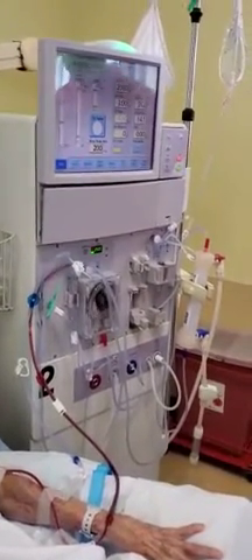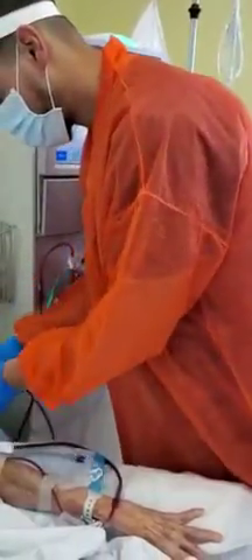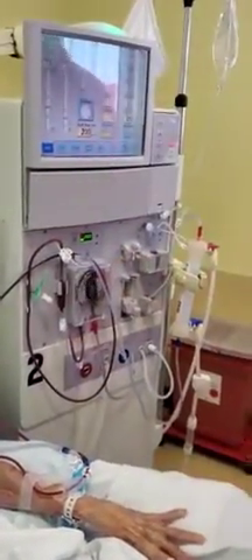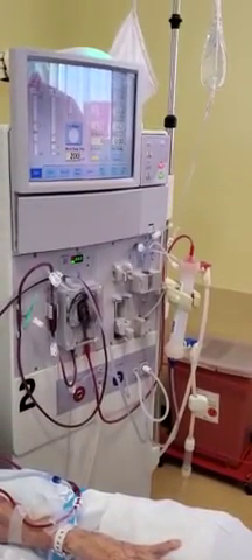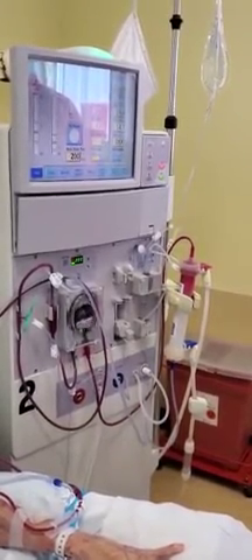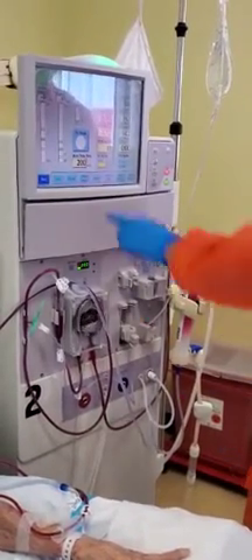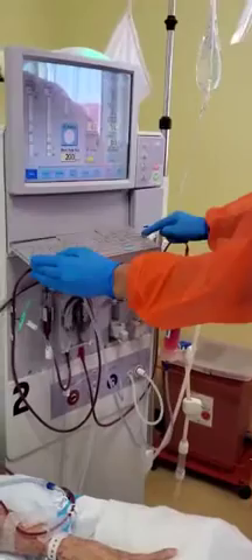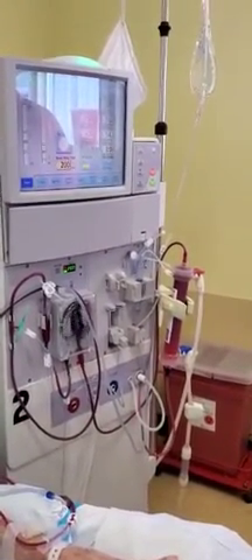He's securing his lines to make sure there are no accidents, just as an additional precaution. We also have to manually start the patient's treatment, and he's waiting for the blood to come in or to be sensed.